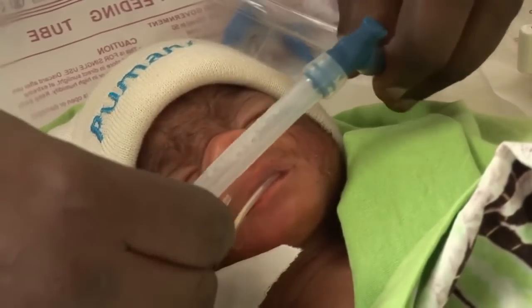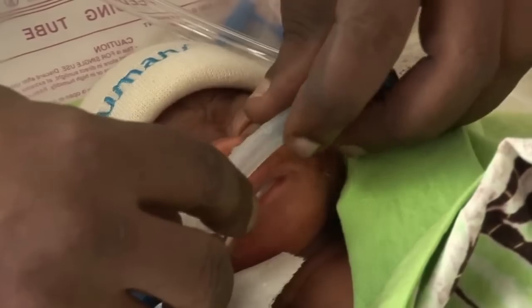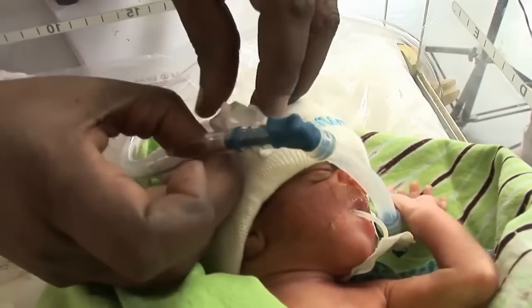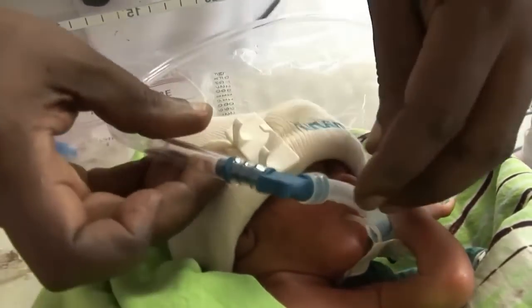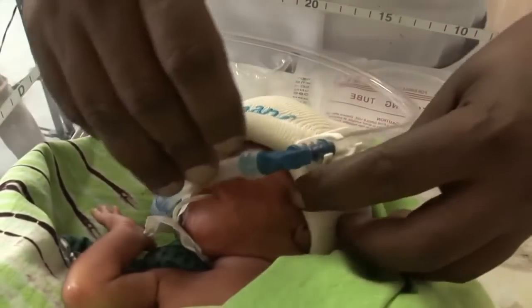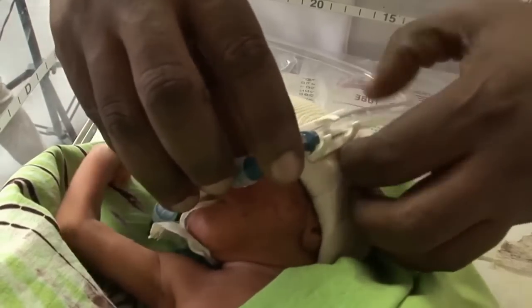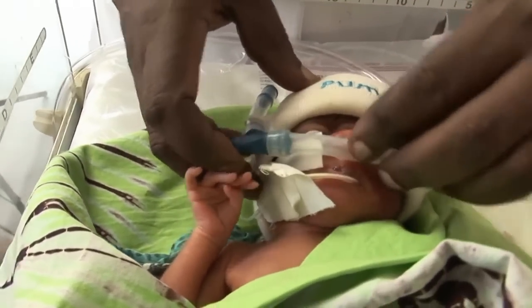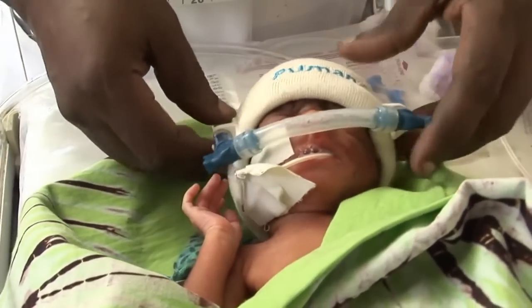Now put in the prongs to be sure they fit and measure where the clip needs to go on the hat. Put the clip into the brim of the hat and attach the tube. Do the same on the other side. Now make sure that the prongs are properly placed in the nostrils and that the water is bubbling.